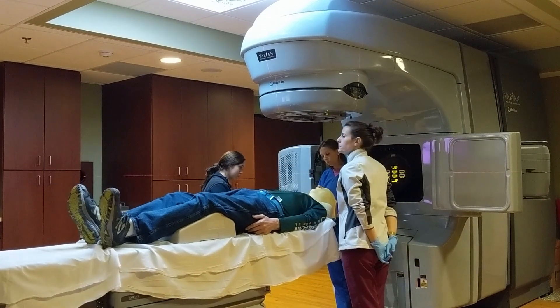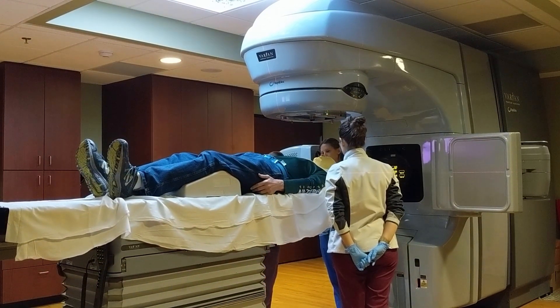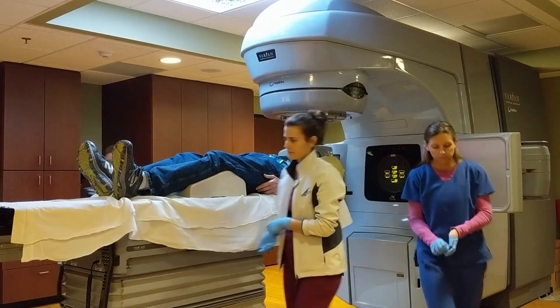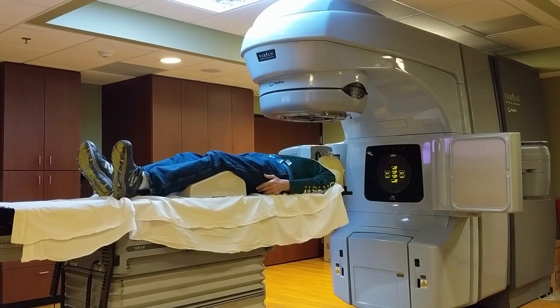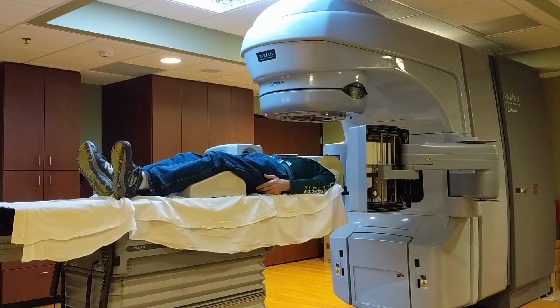After the mask is applied, the table is raised up and the therapists try to put the table in the most accurate position possible. And then once they leave the room, the piece of equipment goes ahead and does some additional analysis.